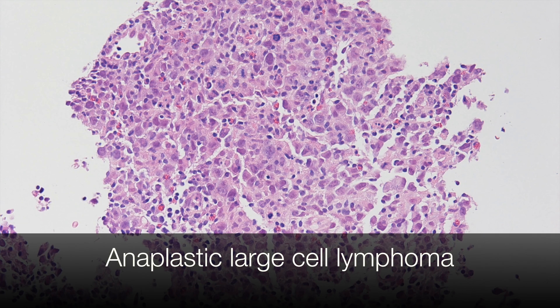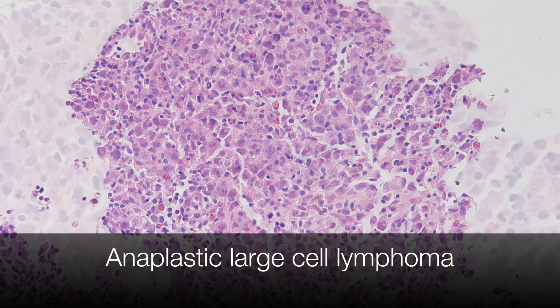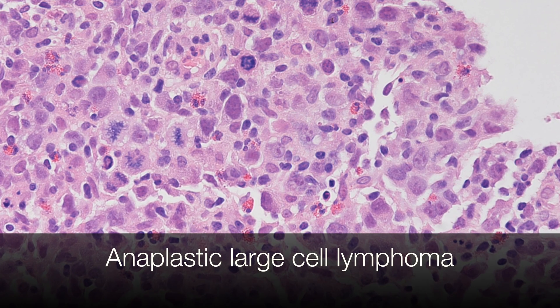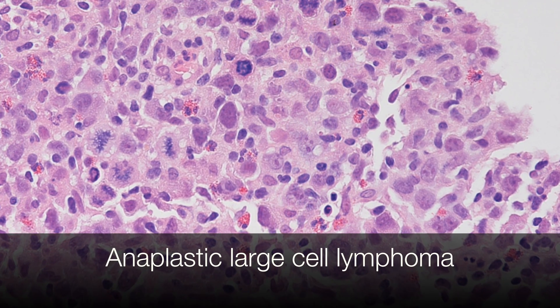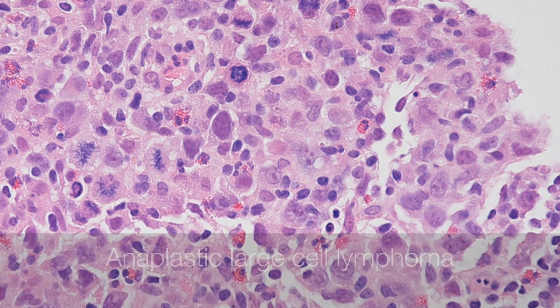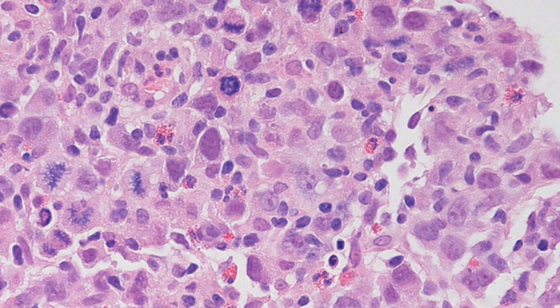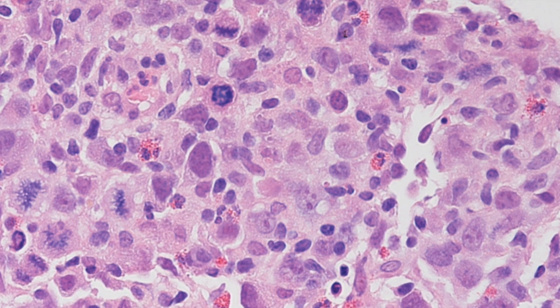This is an example of anaplastic large cell lymphoma, and this is a higher power view of the tumour. You can see that the nuclei are pleomorphic — that means they are very varied in size and shape. There are also lots of mitotic figures, which is a feature of anaplastic tumours and anaplastic areas of tumours, indicative of rapid growth and aggressive behaviour.